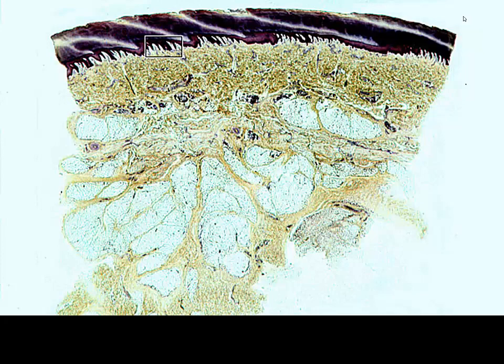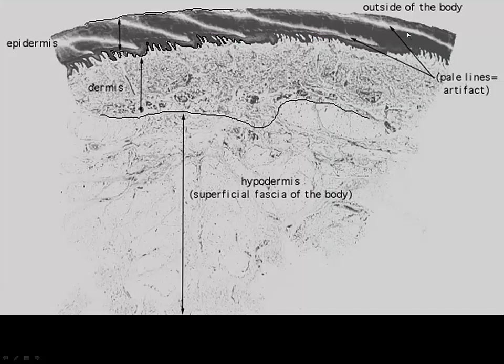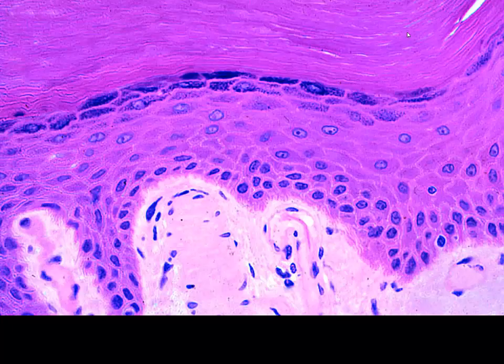Another pretty interesting stain. Again, with this, you can see a lot of the collagen fibers, adipose tissue here in the hypodermis. There we can see our dermal and epidermal papillae, and that's just stratum corneum. Just different views, and this is really the key to being good at histology, looking at as many different samples as you possibly can find access to.